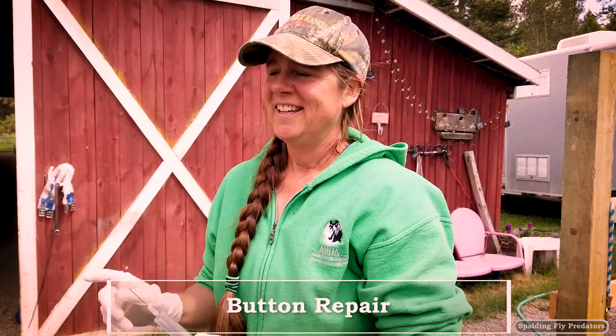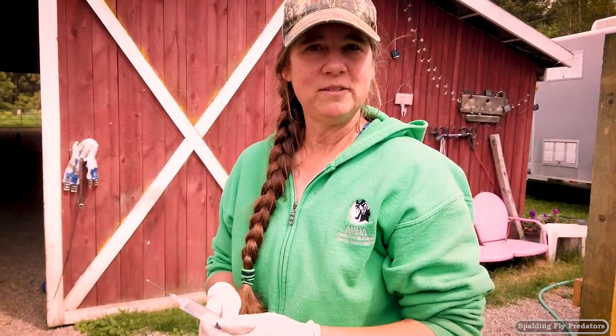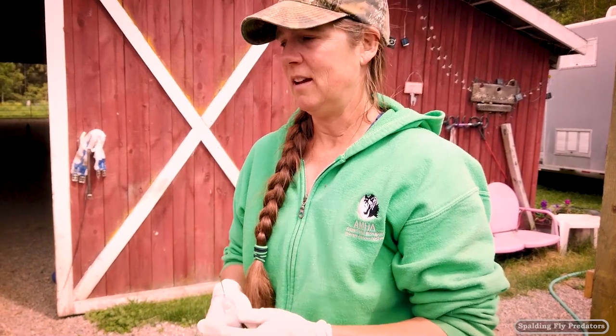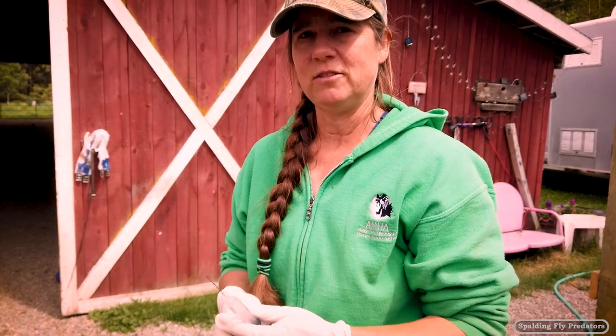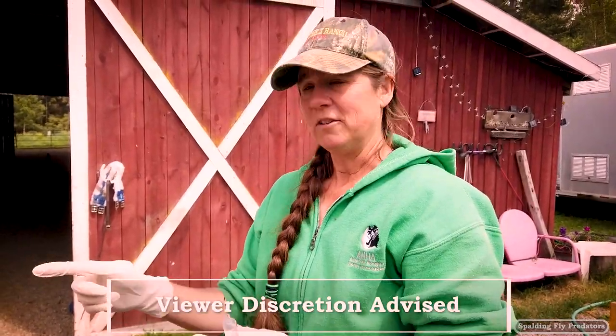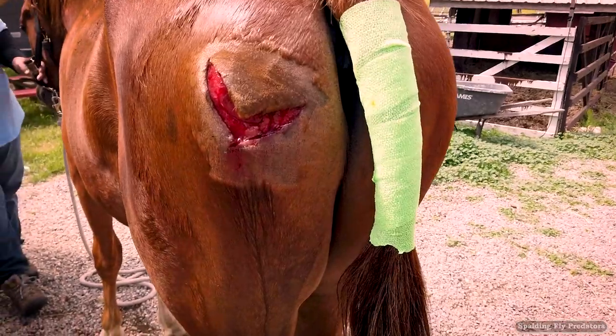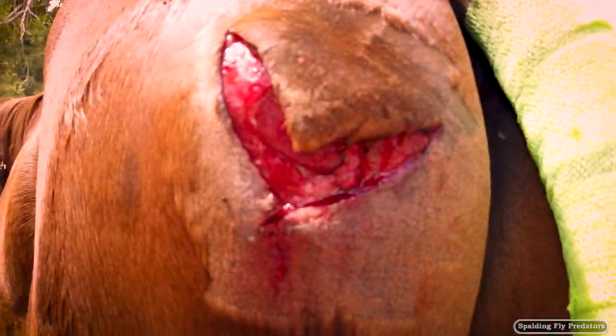You are on the road with Dr. Jenny. Today we have a little yearling that cut his bottom open, so we're going to repair this using a tension-relieving technique that I like to use — that's just a bunch of buttons — and we're also going to put a drain in it. Karen, can you get a picture of what we've got going on right here? Apparently he cut himself on just a little metal bolt or something.